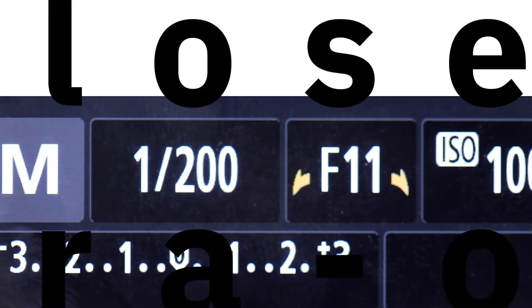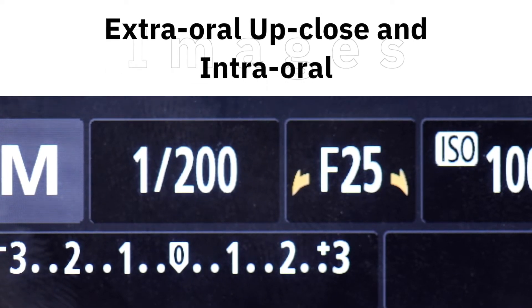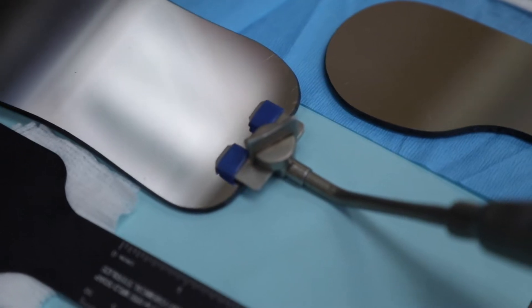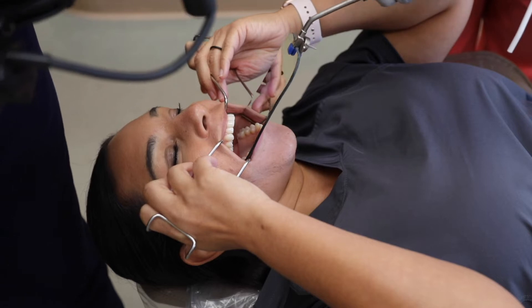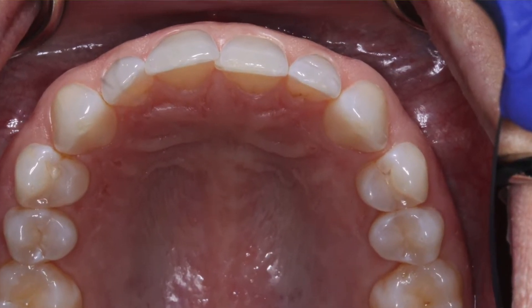For these images we will be shooting using an aperture starting point of f25. When we use the mirror images I will often have my assistant use a mirror handle. I find this especially helpful for the occlusal photos to minimize accidentally getting the assistant's fingers in the final image.